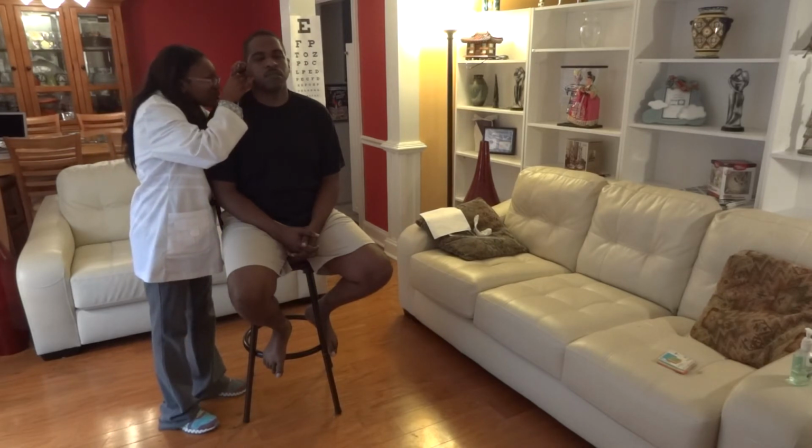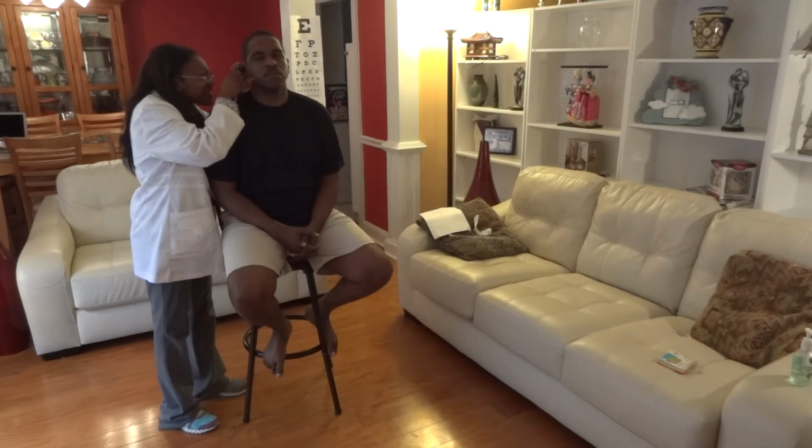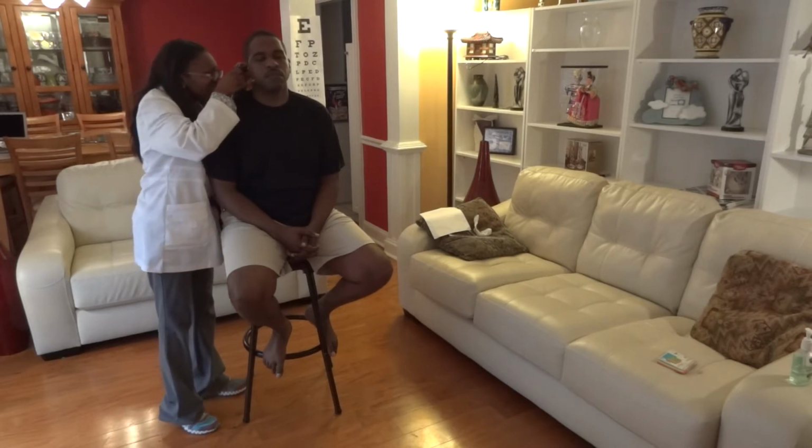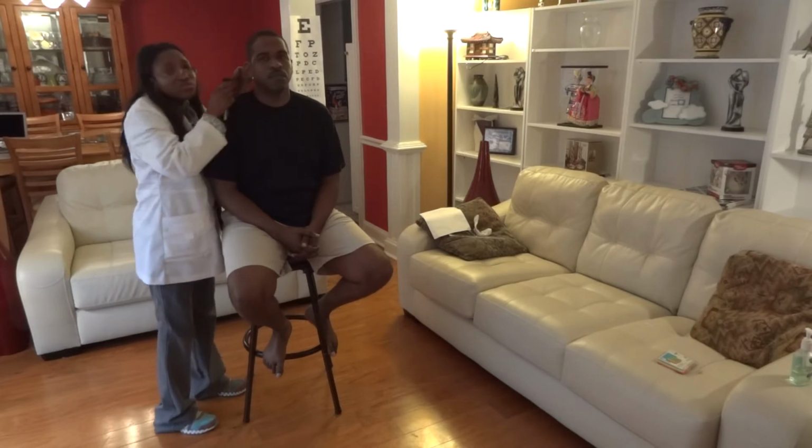And so you do the same thing on the other side. You're going to do it on the right side. So we're going to assess the right ear the same way we assess the left ear. Going to go all the way around. We're going to notice the light reflex of the tympanic membrane. It is within normal limits.